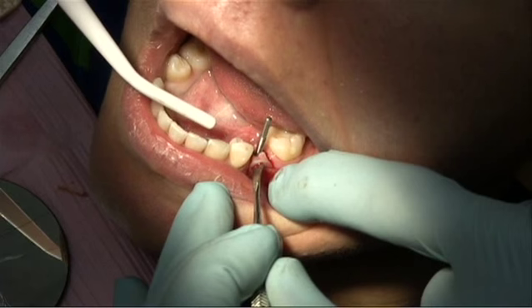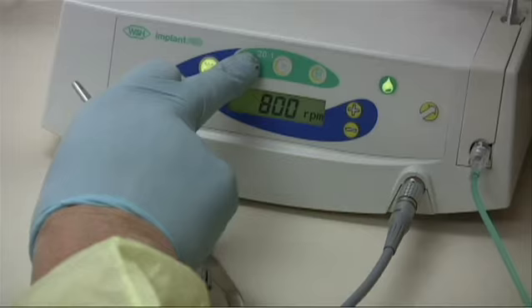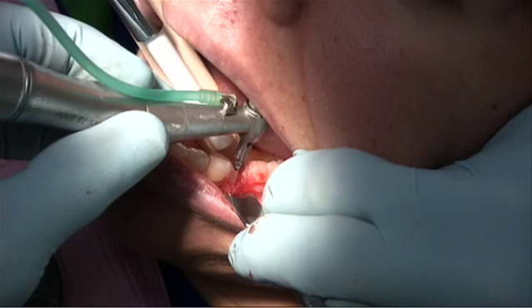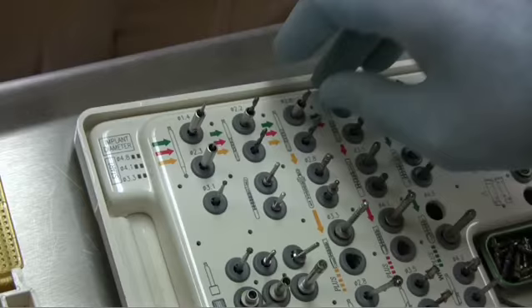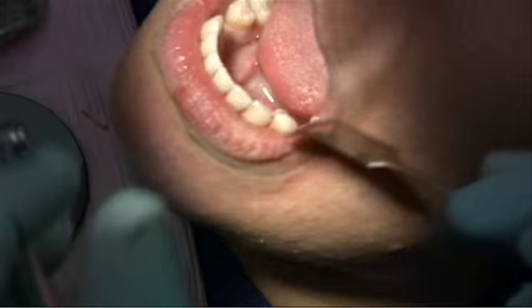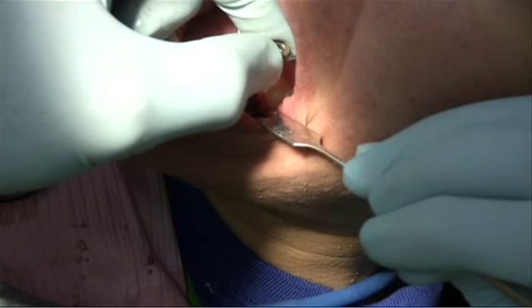The position is perfect. The guide is reinserted and we continue to enlarge the osteotomy with the 2.8 millimeter drill, followed by the 3.5 millimeter drill. A 3.5 millimeter depth gauge may be used to check the depth, followed by tapping of the bone and insertion of the implant. In this case, a 4.1 by 10 millimeter Straumann is used.